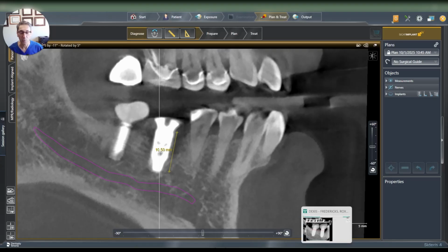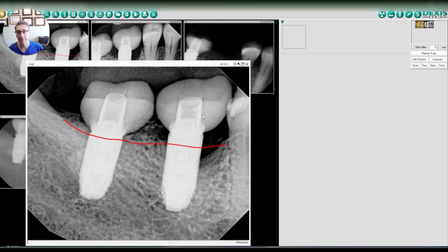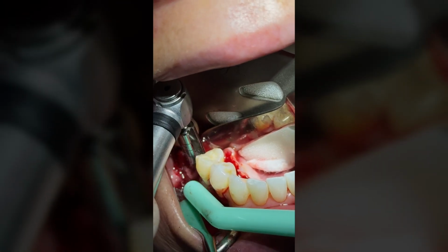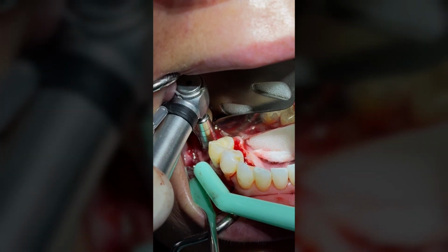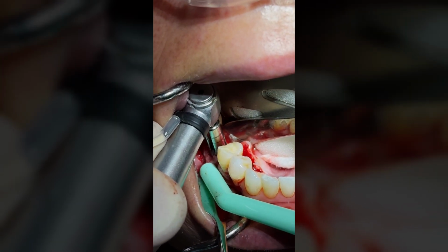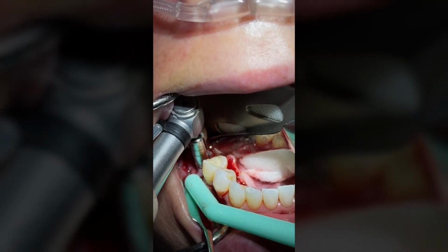So what's stage 1? Stage 1 is removing the implant. As you can see, there's a crown and an abutment there, and we have to remove those. And here's a short video of the implant removal. As you can see in this video, we use a trephine burr, with copious irrigation and a special speed. We're going to go all the way through the implant.